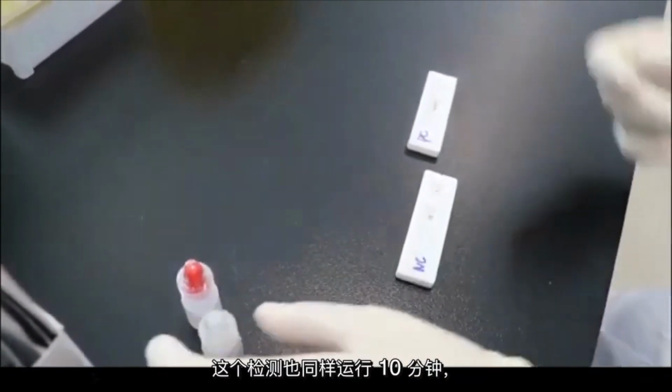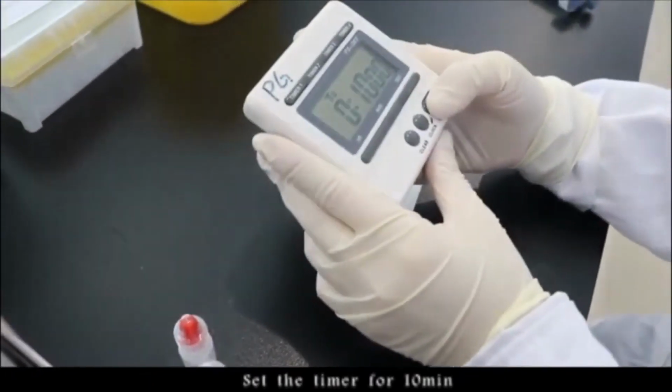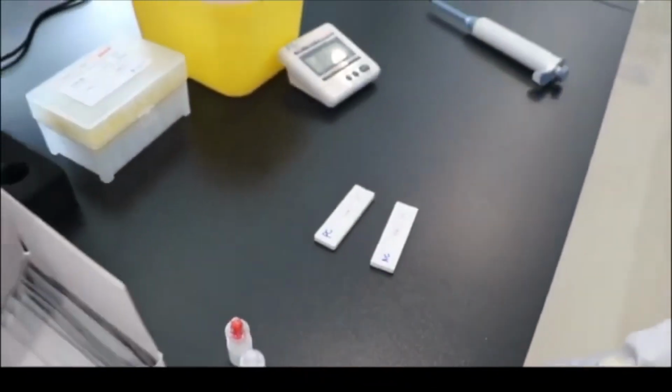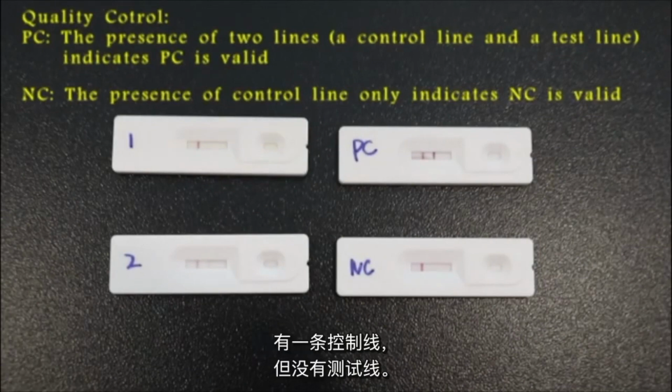Again, this assay is run for 10 minutes with the positive and negative controls. And here are some examples. You can see the positive control has got 2 lines, negative control 1 line, and each of the sera samples that were run were both negative and both have a control line but not a test line.